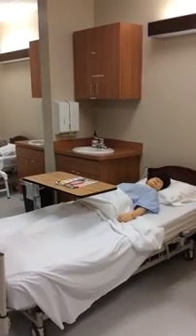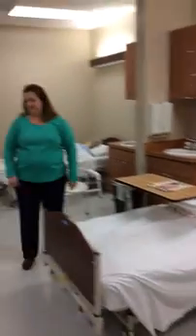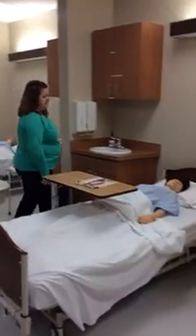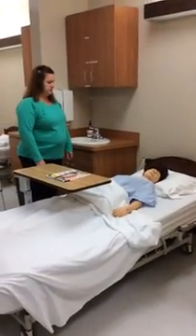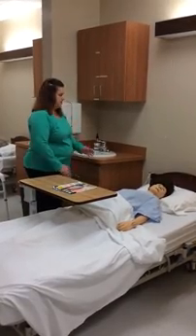This skill is performing catheter care on a patient. I'm going to start. Knock, knock, knock. Hi, Miss Jones. My name is Jennifer, your CNA today. I need to do catheter care on you. I'm going to wash my hands and get my supplies.